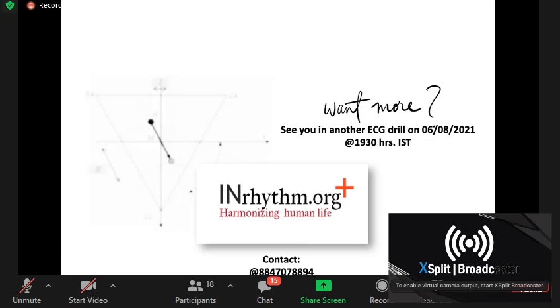If the patient is able to do some form of physical activity, then probably you will put the patient on a Modified Bruce protocol. And depending on the age, you just calculate the chronotropic incompetence index, or CI. If the CI is significantly lower, then probably the patient has chronotropic incompetence. That may be a spectrum of sick sinus disease.